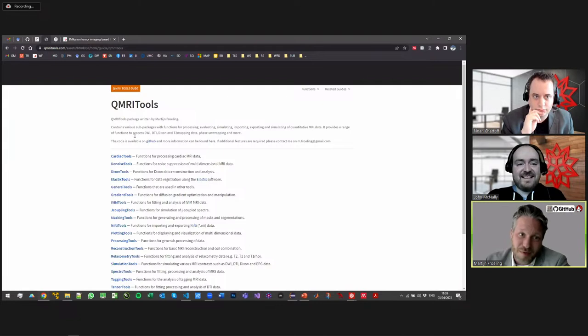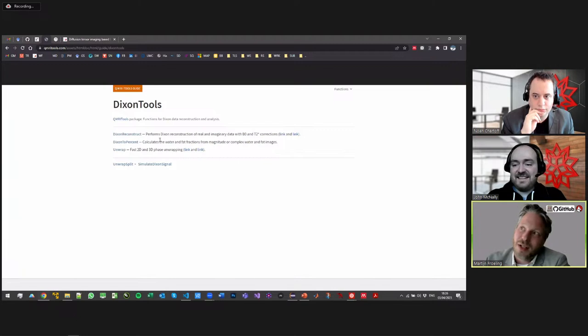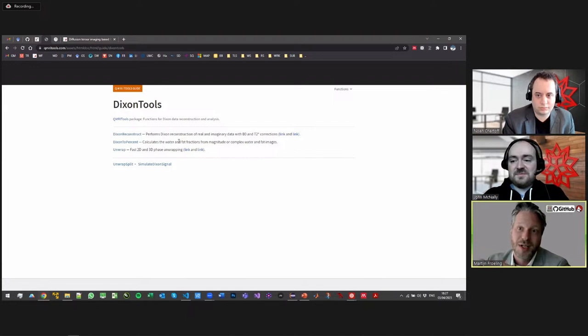So this is, therefore, this documentation, which is actually documentation via the browser. I started adding documentation to it. I wish I had started sooner, because going through 80 functions, figuring out what each did and commenting everything was painful. But now I'm quite concise in that. When I write a function and add it to the toolbox, I comment the code: what does the snippet of code do? Then I write the documentation for it. All these pages are automatically generated from the usage message of the function. That usage message generates a documentation page that you can add to the guide pages, and most of it is automated, luckily.